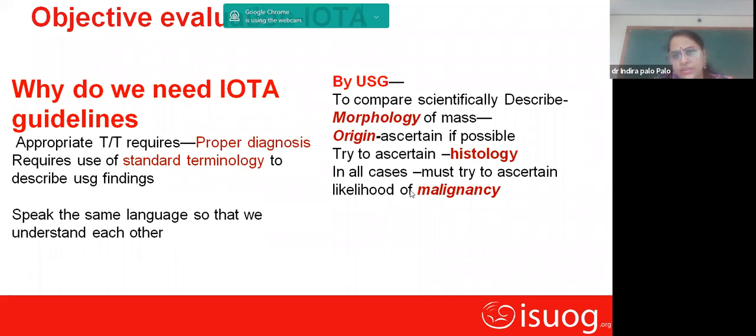By ultrasound, we can scientifically describe the morphology of the mass. If there is a guideline or consensus, everybody can describe how a mass has been characterized.